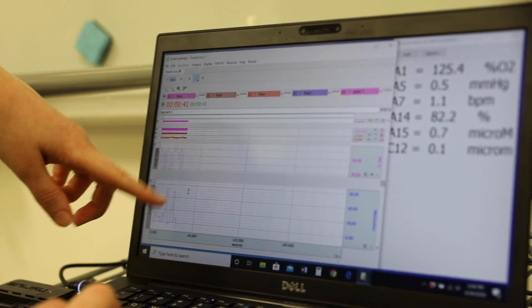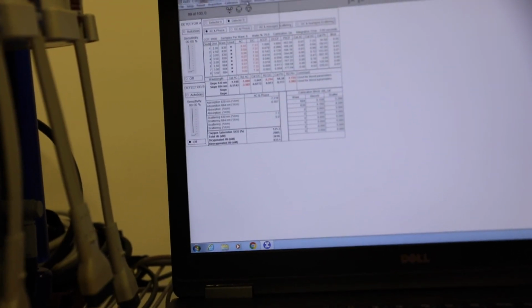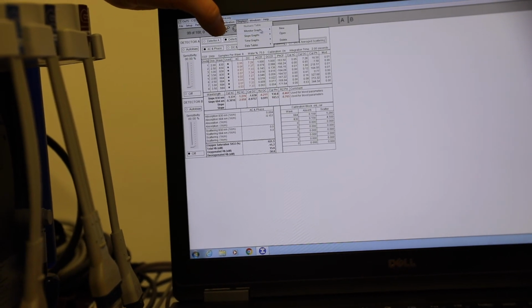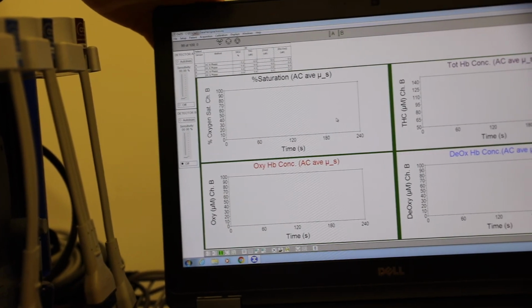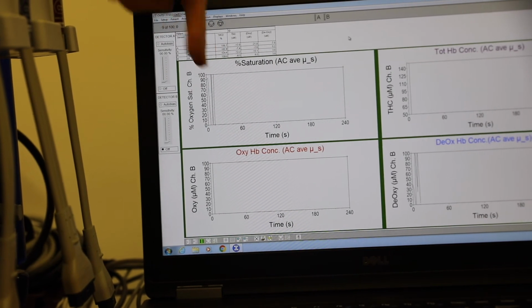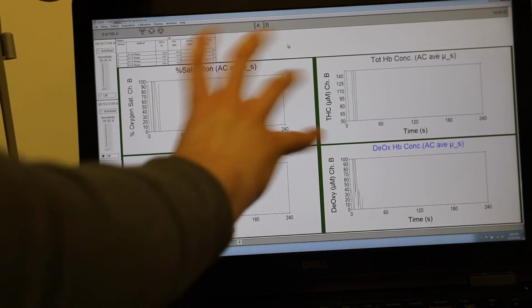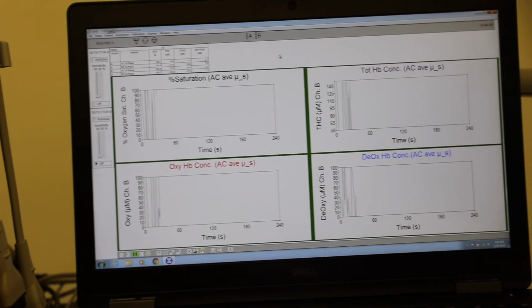And so as this is reading, we know that this is reading accurately, and we can also double check this by coming back over to the other computer and coming here to the displays, and we're in the numeric table right now, so we're going to go back to monitor graph, open, probe B again, and it'll bring us back here to these graphs. And because we just came into this graph, it's only going to start showing the data from the time we started looking at these graphs. So as you can see, it's starting to show all these different spikes. And these are the 4 measurements that we're getting from the NIRS probe, rather than the other computer is only currently showing 2, but we can look at all 4 on the other computer as well.